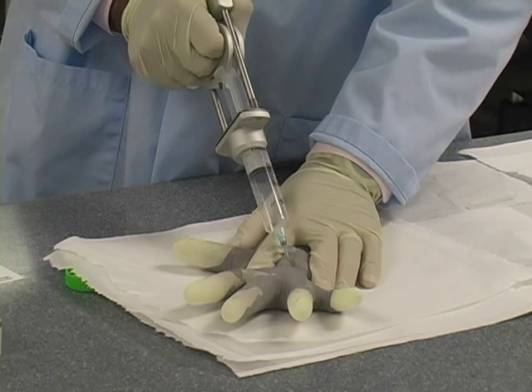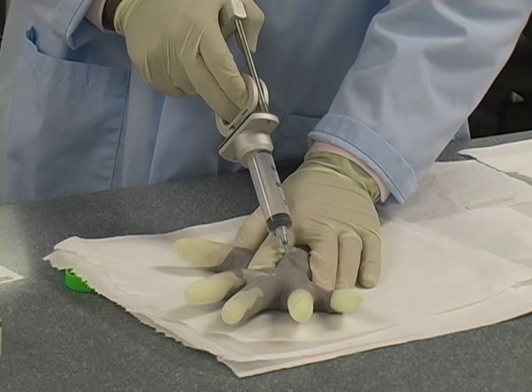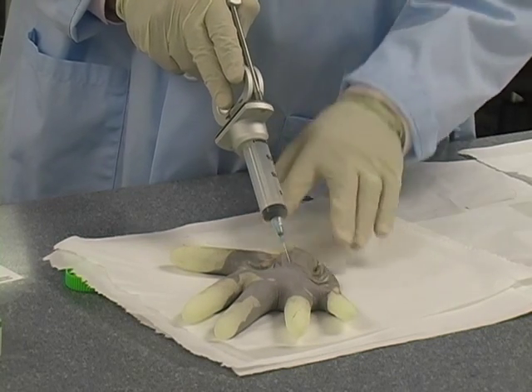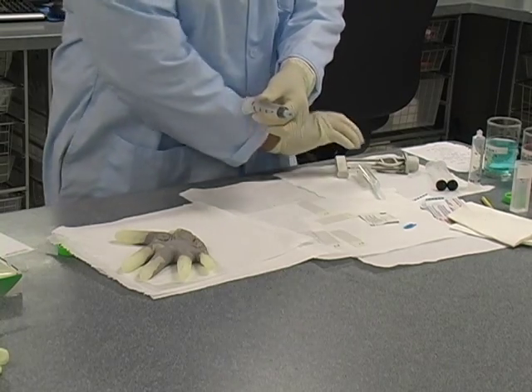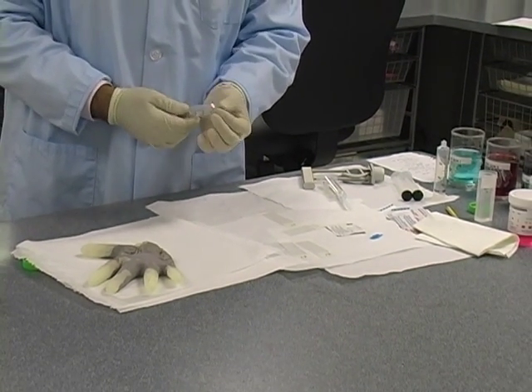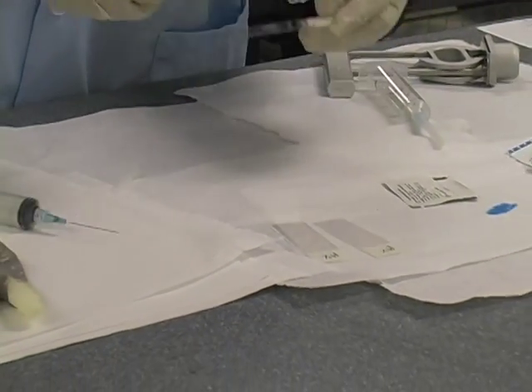You won't always see a flash of blood or material in the needle, but here we're starting to see a little bit of build-up. This is key: before I remove the needle, I release the suction inside the tissue. Otherwise, when you take the needle out the material sprays all over and you've lost your pass. Once I release the suction, I remove my fingers and take the needle out — I haven't lost any material. Then I remove the syringe from the Kimiko gun, remove the needle, pull back on the plunger, and have my slides ready to express the material and make my smears.